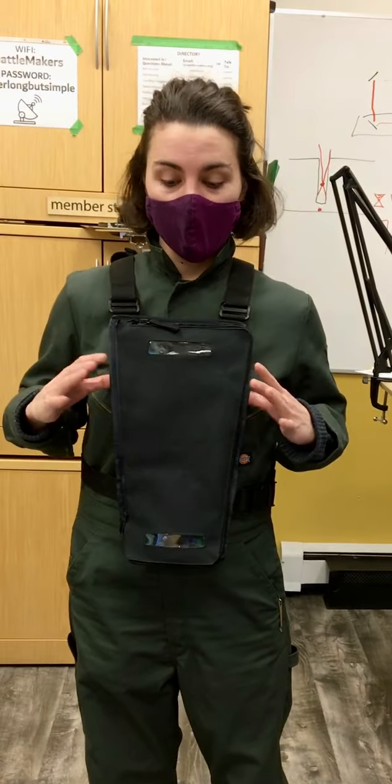Hey, I'm Rachel and I'm working on a prototype harness for the Mira guidance system for the blind.